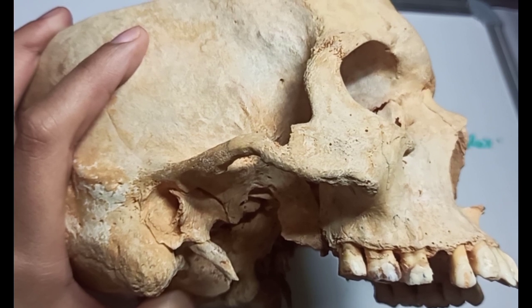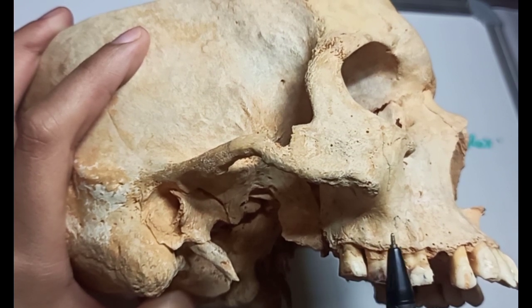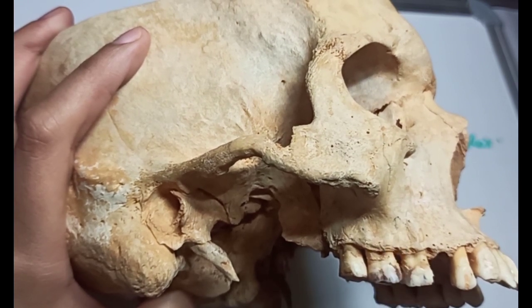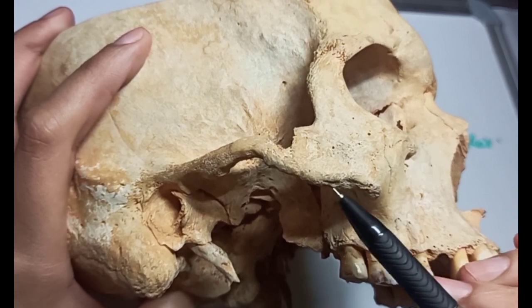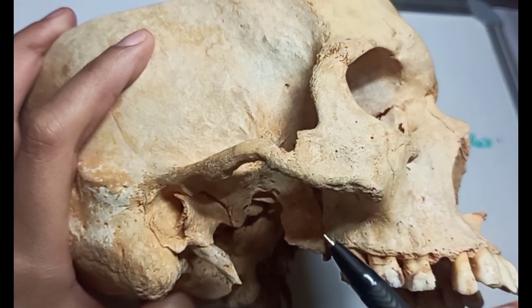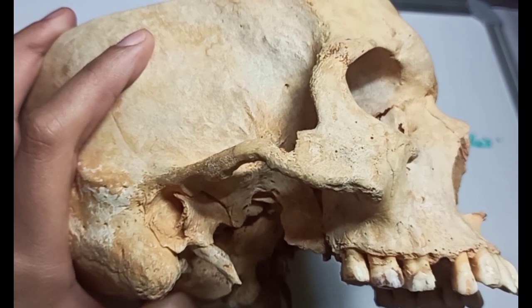The area of insertion is the height of the mucobuccal fold over the second molar area, and the target area is posterior, superior, and medial to the posterior surface of the maxilla.